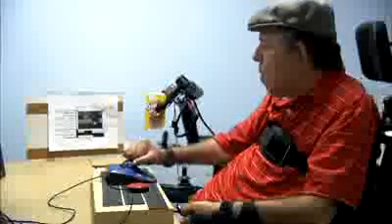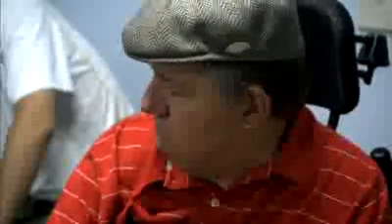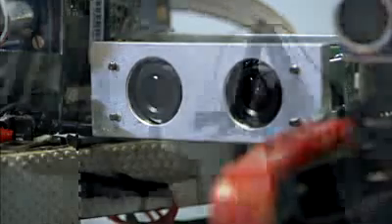The technology is designed to help those with spinal cord injuries and limited arm function use the robotic arm to complete everyday tasks like feeding themselves, pouring a drink, or opening a cabinet. What we did is, based on this robot arm, we put our own software interface and sensors and some image processing to help the people and the robot together do some tasks in a very easy way. The value of this type of technology in a person's life is beyond measure.